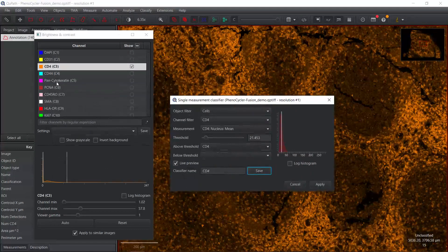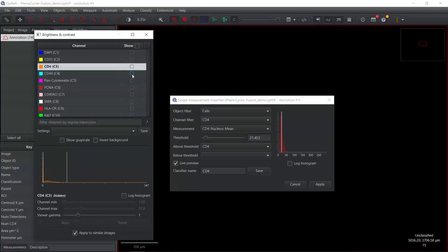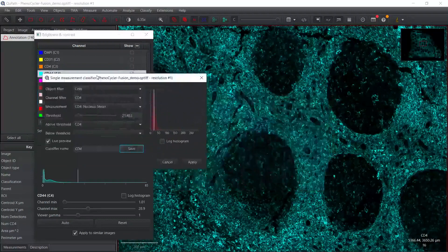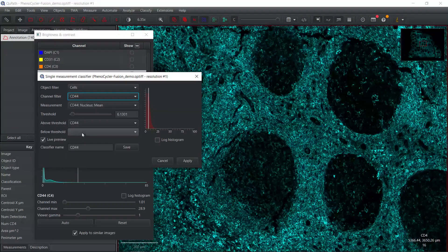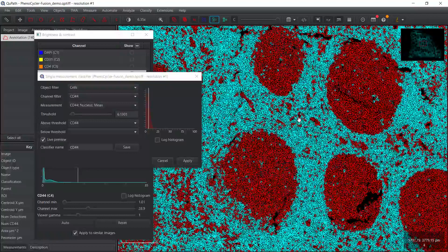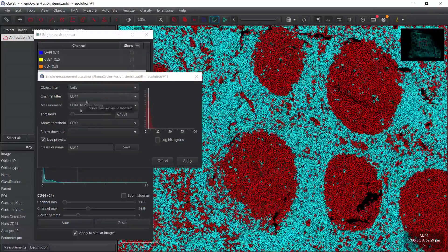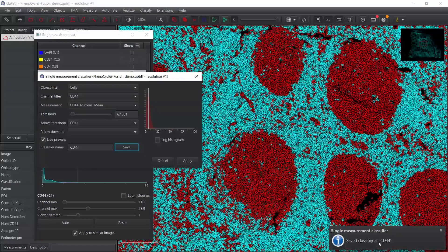So we did CD4, next we can do CD44. We can switch off CD4, then switch on CD44. Again, we need to change the channel filter to CD44. Now we can switch on the cell segmentation again. You can see it is quite good for CD44. We don't need to change the threshold, we can just save it. You can see we saved the classifier as CD44.